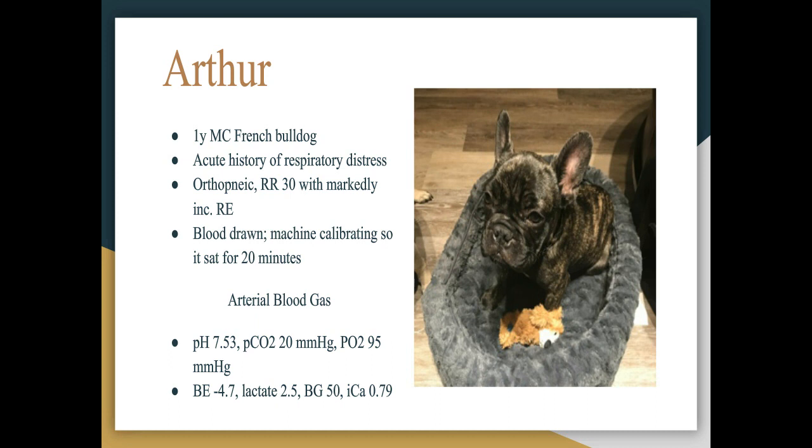First, as we discussed with the acid-base status, for every minute that a sample sits, the lactate may increase by 0.01 millimoles per liter. And therefore, sitting for 20 minutes probably increased our lactate from 2.3 to 2.5, and also would have caused a similar change and a decrease for our base excess. Sitting for that long may have also allowed for metabolism of our glucose in the sample, so that should be interpreted with caution.